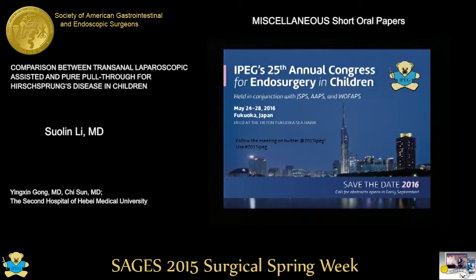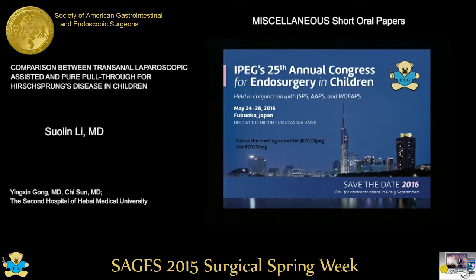In the beginning, we carry out the Soave procedure mobilizing the rectum, and we use the working instrument through the rectum muscle, advancing with clips into the pelvis, through the pelvis into the abdominal cavity. We then obtain several specimens for biopsy prior to mobilizing the colon.